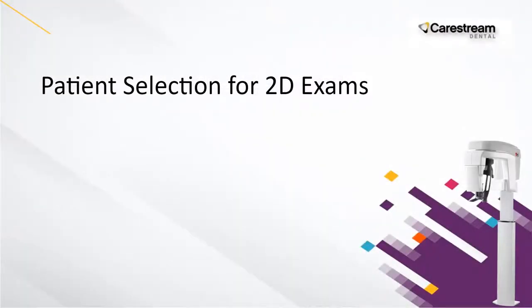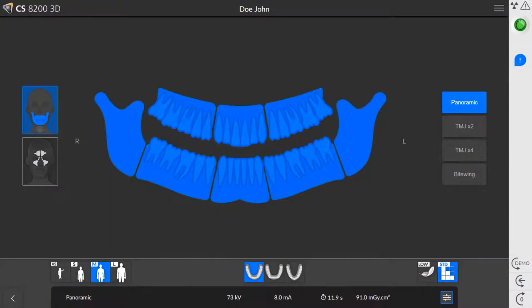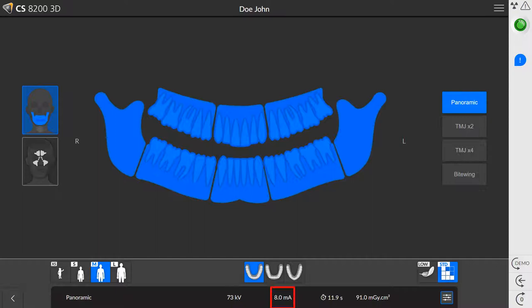For patient selection in all 2D exam types, you have two settings that can be adjusted. On the main interface, select the patient's head size: child, adult small, medium, or large. When you select the appropriate head size, the KV and MA are adjusted automatically.